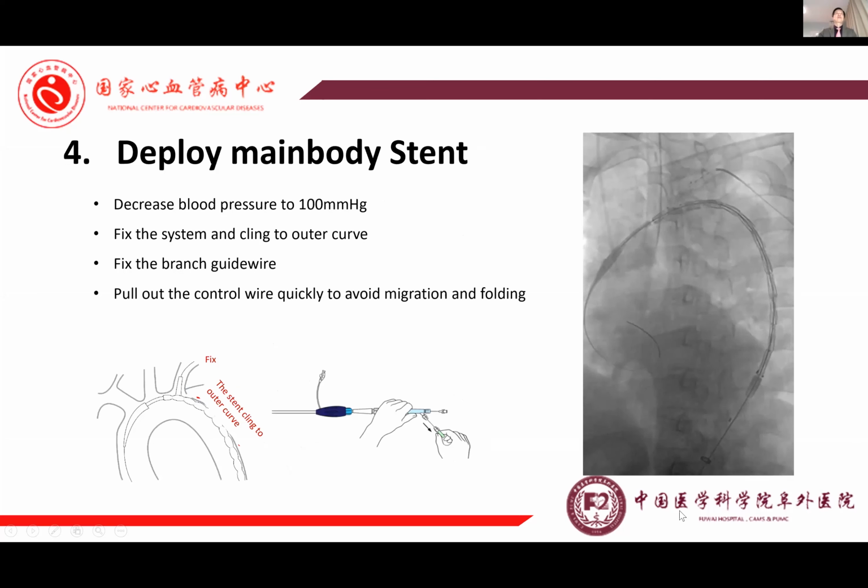This time, as we deploy the main stent graft, we will see the details. So you may find it here. That's to release the big stent graft. Then it's stable. Then your assistant with a Castor goes forward to prevent injury of the LSA. So that's very important. Then take it away, then release the branch stent graft.